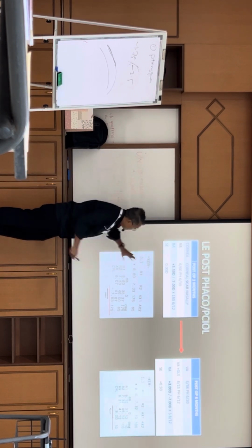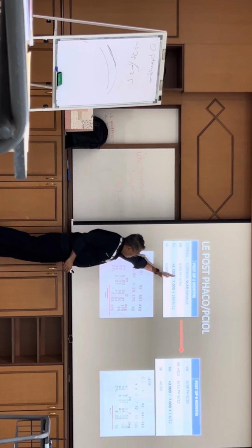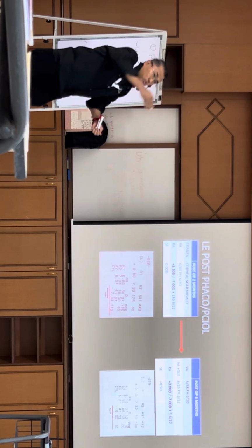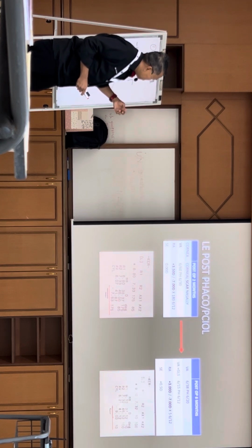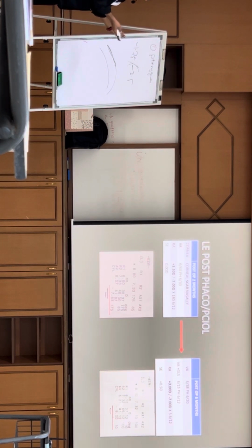So this is really nicely demonstrated. If we are starting to look at refractive surgery, the lens refractive surgery, we are going to decide how the cylinder is and how the sphere is by itself before we go to the spherical equivalent mean. So that's very important. So that's basically the take on it, but what to do with this patient now? Is that the question, or is it whether the patient is happy? If you encounter this kind of case again, how do you avoid the hyperopic shift?